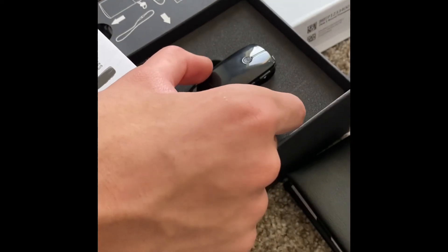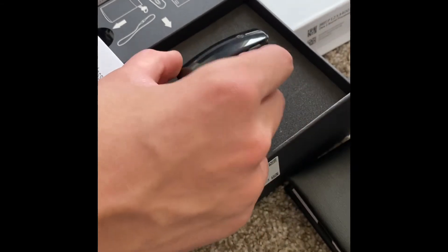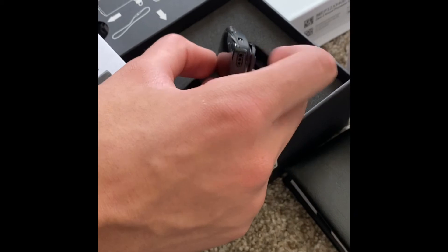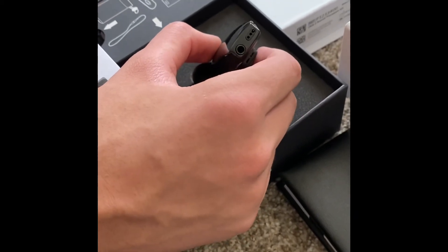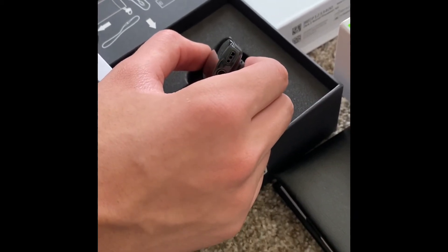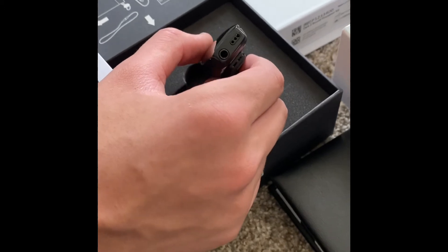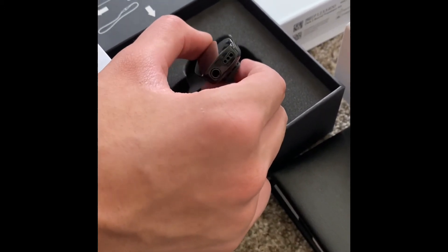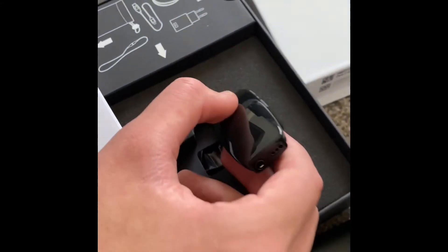You need the audio cable to connect it to a laptop, and you can also connect it to a PlayStation controller and an Xbox One controller too, which is sweet.